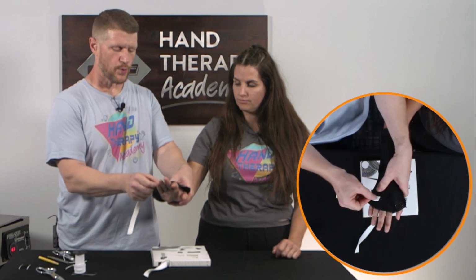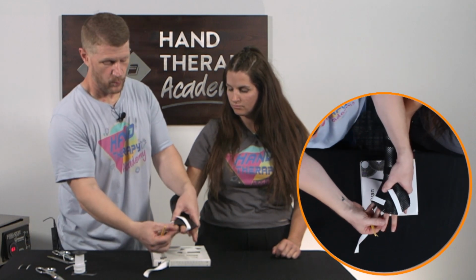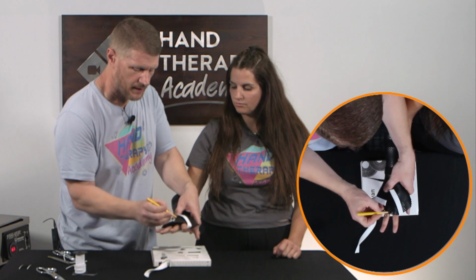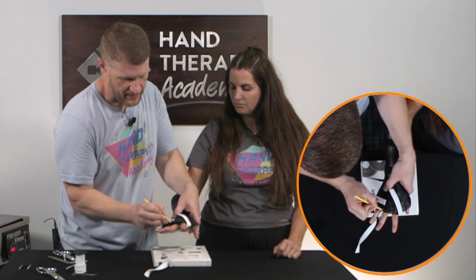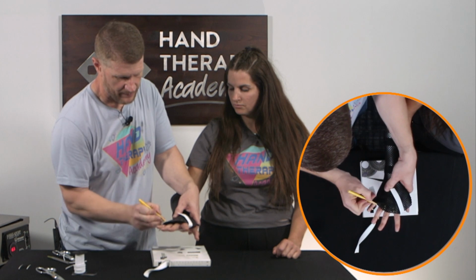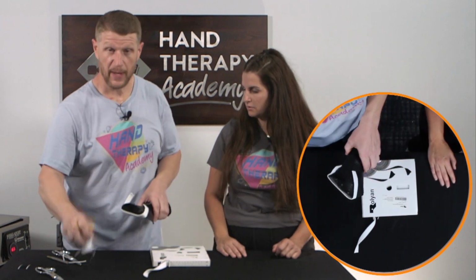Okay, so once I know where this is going to go, and I lay it there, I'm going to have her fingers spread where they naturally fit, and I'm going to take a little marking wax pencil, and I'm just going to mark a spot on each of those that are about 1/2 inch apart, and that's going to give me a guideline on where I want to put, and I've got to pull this one back a little bit. I'm going to have to put a hole down here, but that's okay. Where I want to put these through is this thread that's going to loop through.